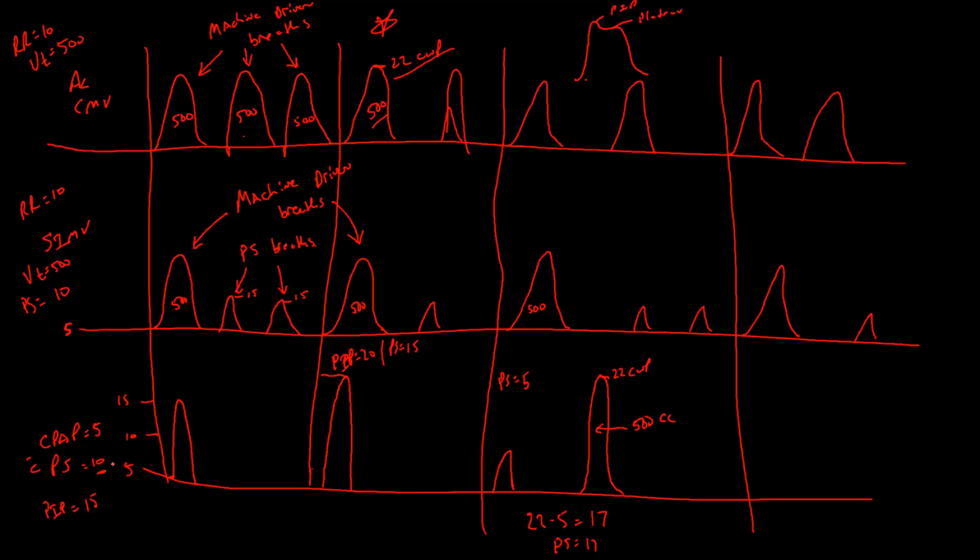Okay. Now on the exam, I've noticed that some of the answers are add pressure support. When would you know to add some pressure support? If you need to increase the tidal volume, because the more pressure support you give, the bigger your tidal volume is going to be.